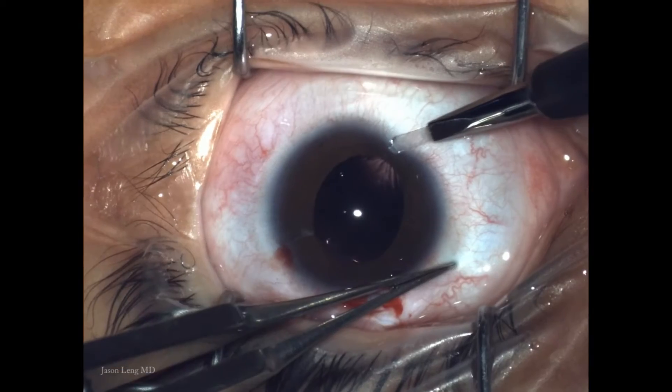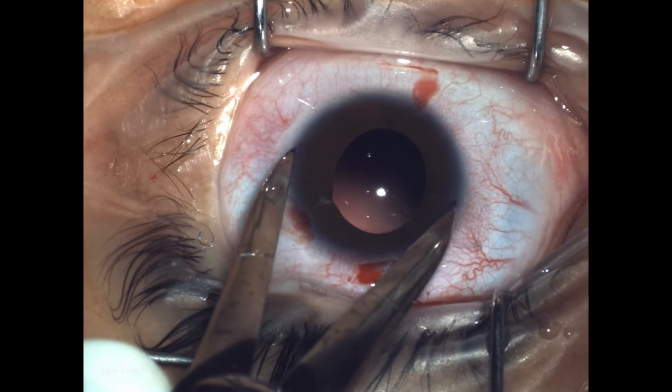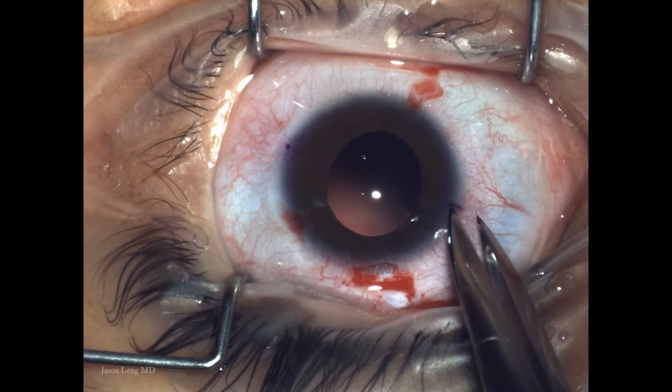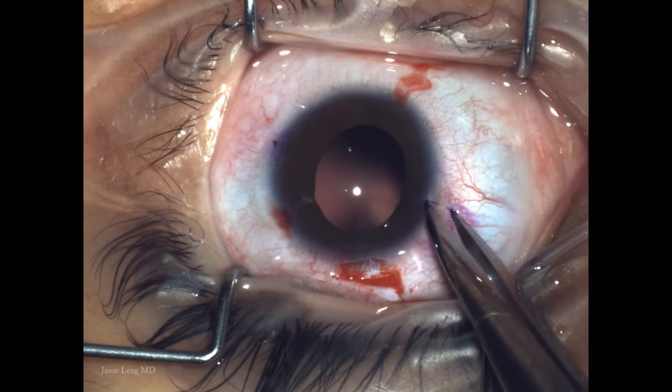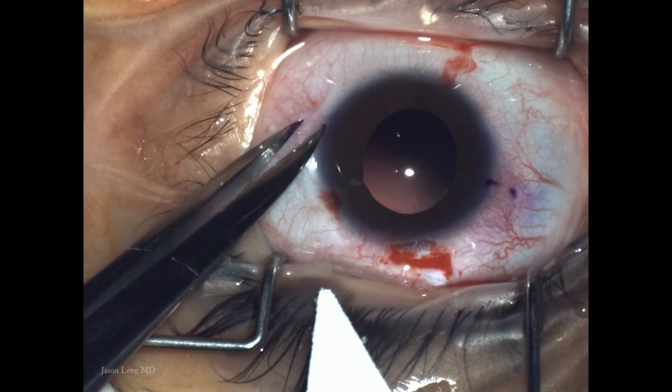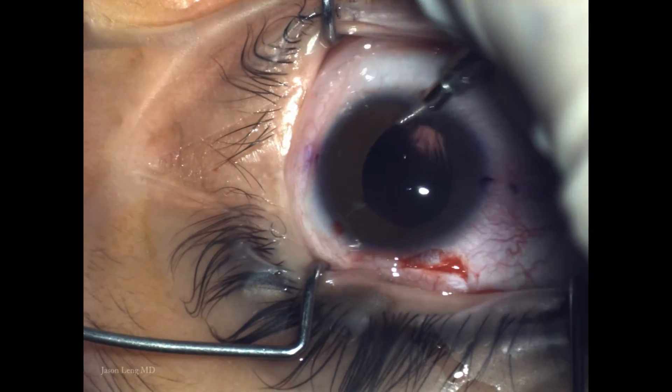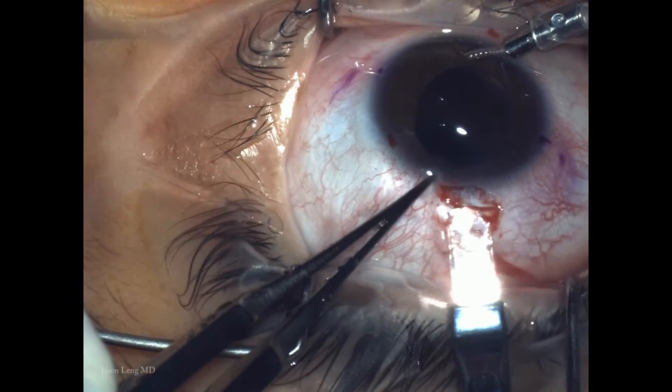I start out sitting superiorly making a mini-scleral tunnel, make some paracenteses, using calipers to make marks 180 degrees apart and mark entry points 2mm posterior to the limbus. I then place an AC maintainer to maintain the chamber.